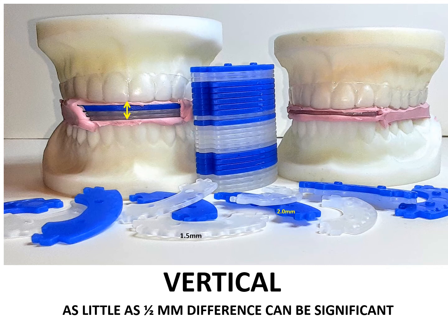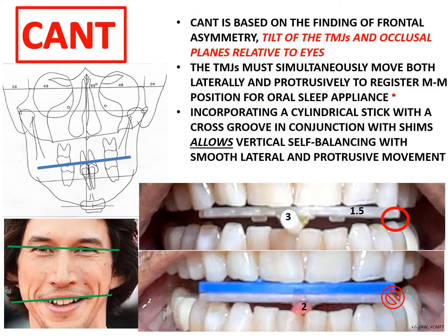When the correct registration of all dimensions is achieved by a combination of shims, fast set polyvinyl material is extruded between the posterior segments, overlapped on the shims and their grooves for a complete full arch bite registration in one piece. Vertical. As little as a ½ millimeter difference can be significant.